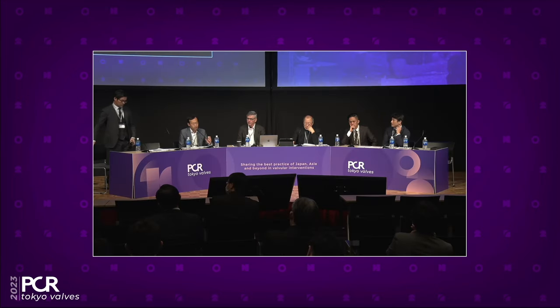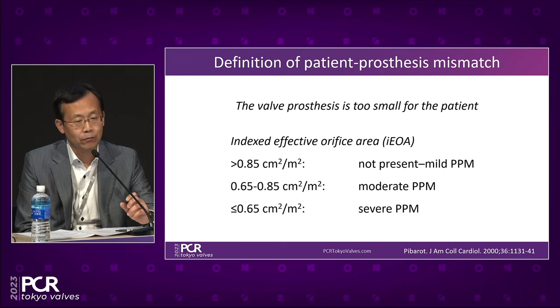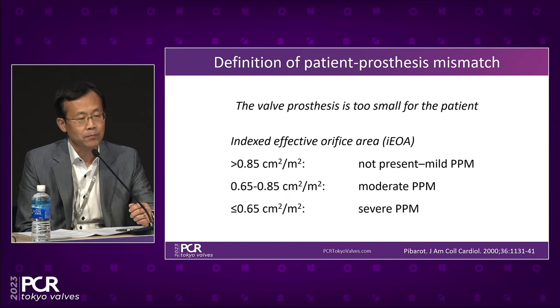Right. For me, if a patient is small built or with very small annulus, if we have to use a very small valve, either a surgical valve or a TAVI device, and the end up gradient across the valve is too high, then I would probably consider it as a patient prosthesis mismatch. For me, any gradient more than 10 would be not favorable. So I would try to lower it down as much as possible, to a single digit gradient at the end of the procedure. Otherwise, if they have PPM, these sort of patients will come back with a faster degeneration of the valve, and will have a lot of symptoms much earlier on than other patients.